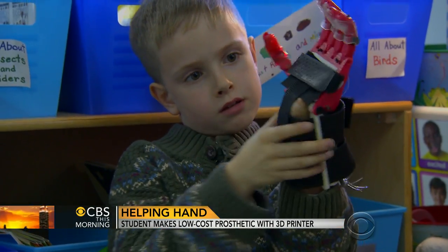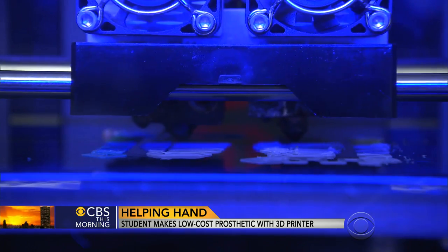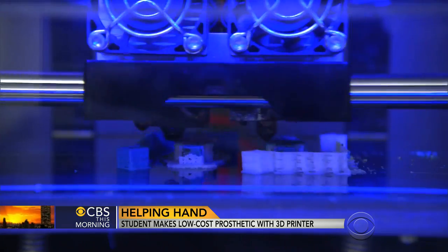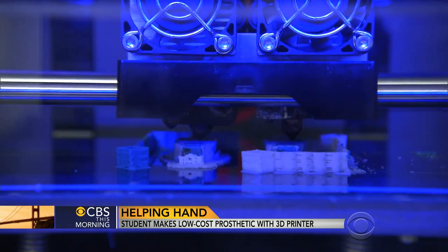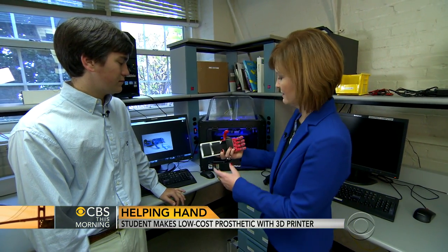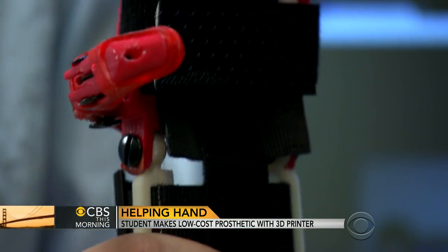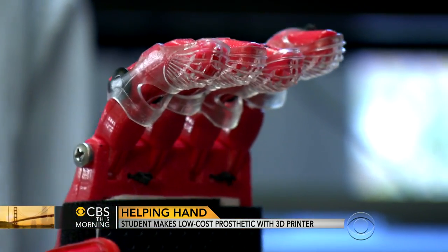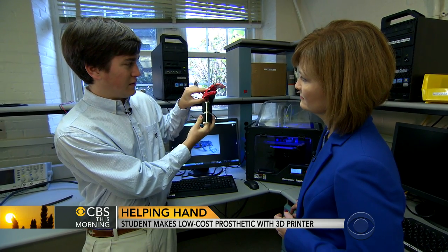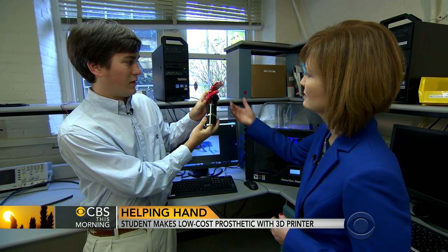He used instructions posted on the internet called the Cyborg Beast, then customized it. The 3D printer builds the parts in under 24 hours, and at the end you wind up with this. The way this works is it straps on to Holden's hand and on to the end of his forearm. When he moves his wrist in, the fingers close. When he moves his wrist out, the fingers open.